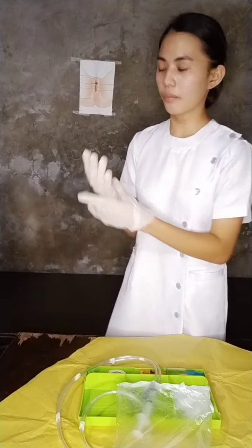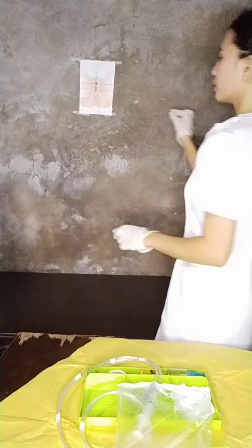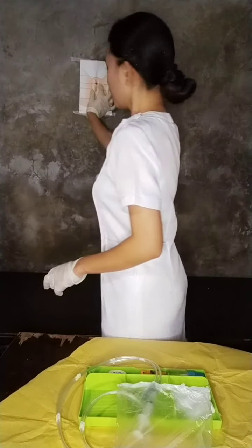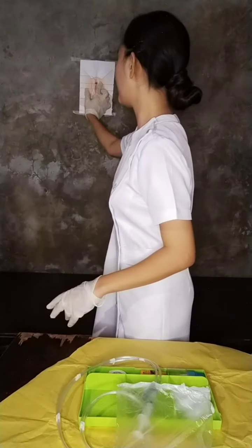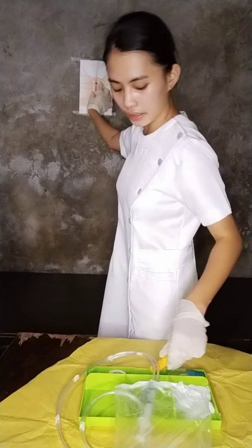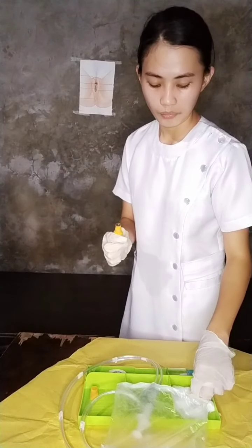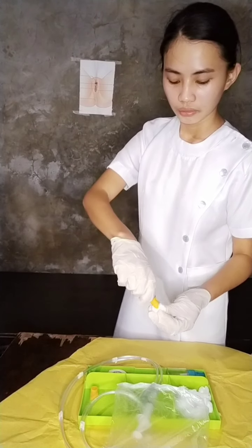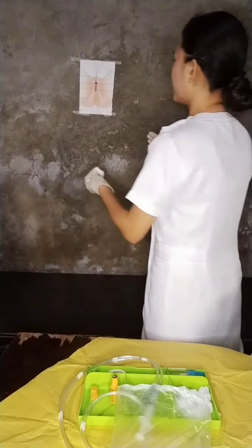And then separate the labia of the patient using your non-dominant hand, with the index finger and your thumb. And then pick a cotton with betadine and do perineal care.